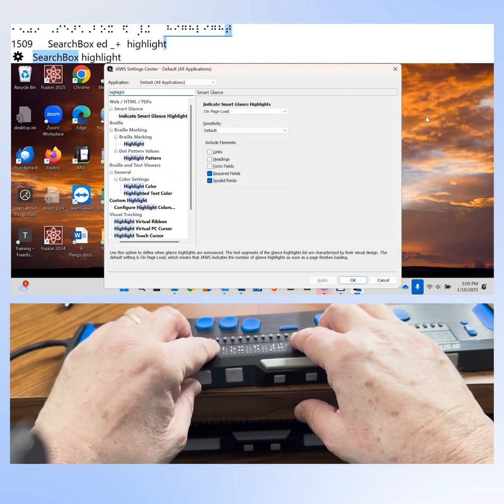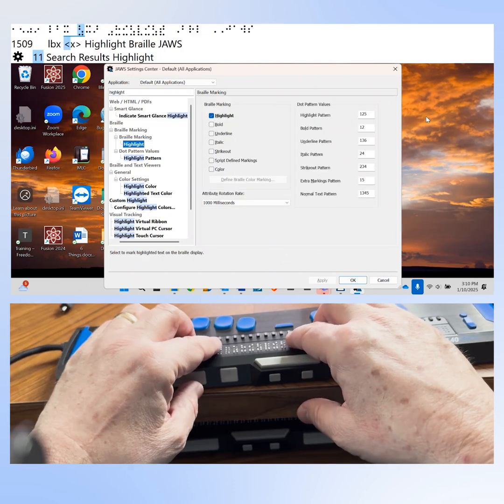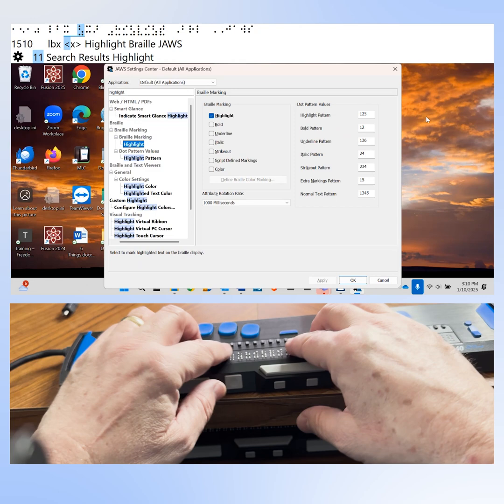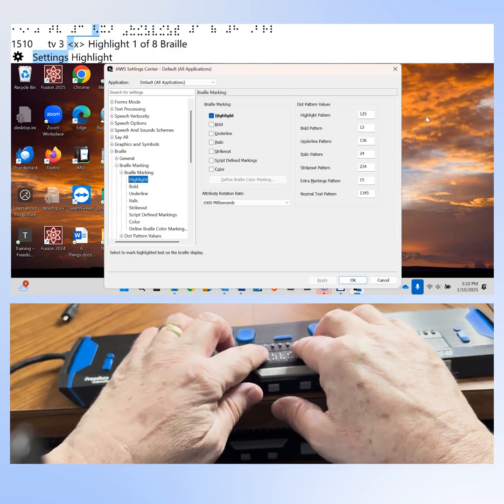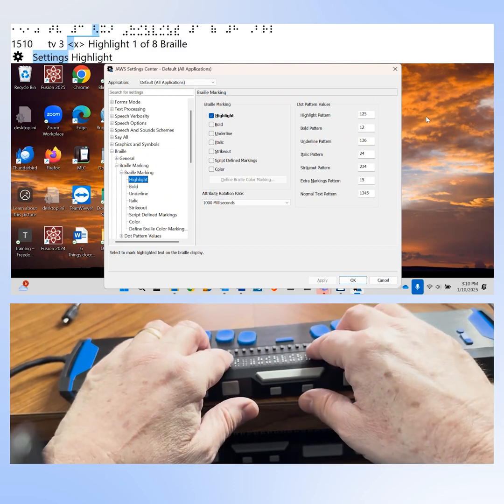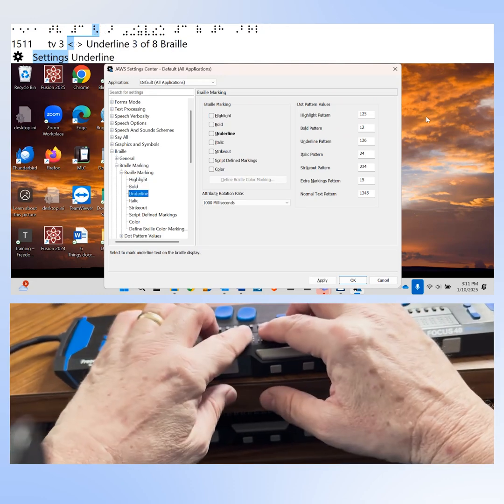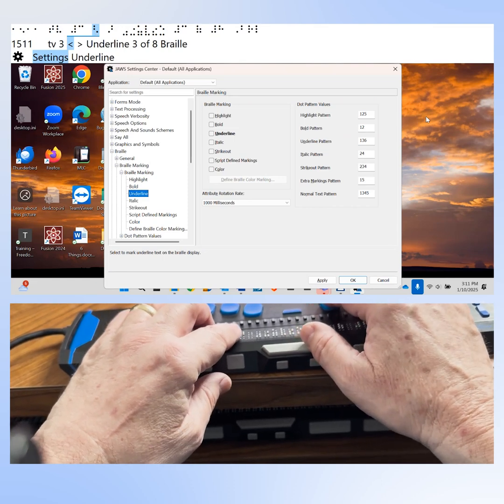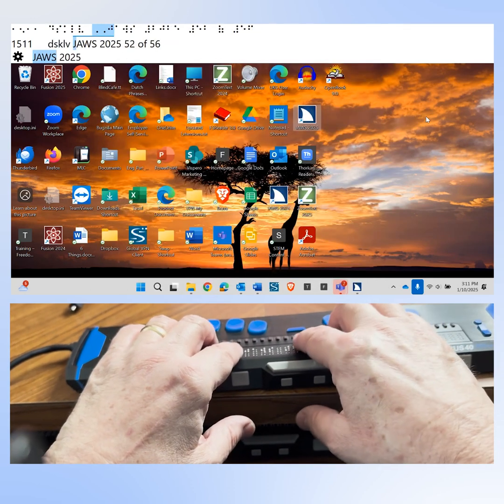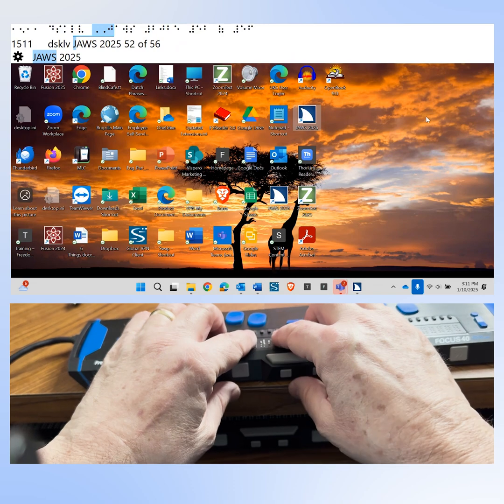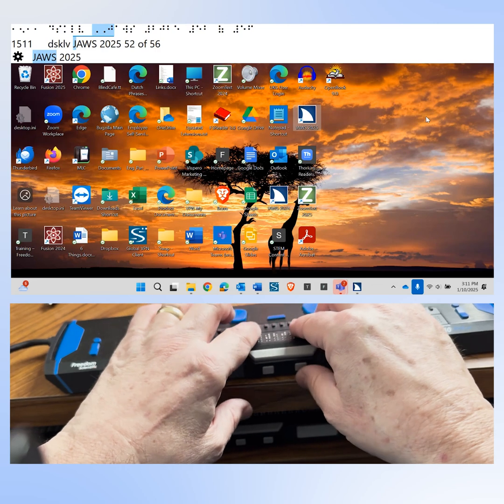Enter the word "highlight" into the search edit field. We get 11 search results. I'll press down arrow using the left rocker bar to navigate to "Highlight" under Braille Marking. Press Enter to move focus to that option. Highlight is currently checked — one of eight under Braille Marking. I can press space to uncheck this checkbox. Tab to the OK button and press space to apply. Now back on the desktop, dots seven and eight are no longer appearing below JAWS number sign 2025.